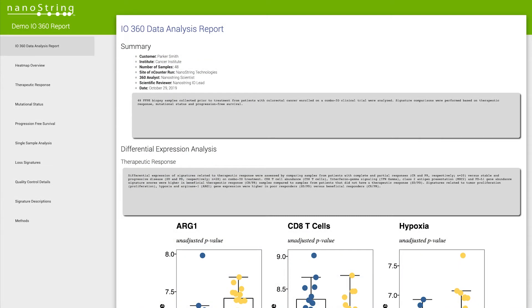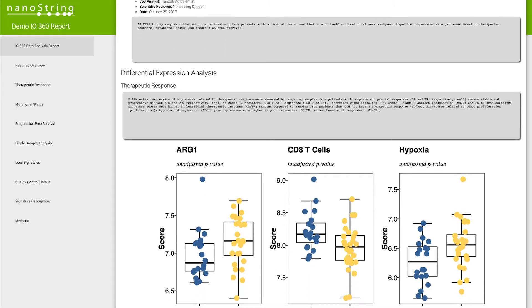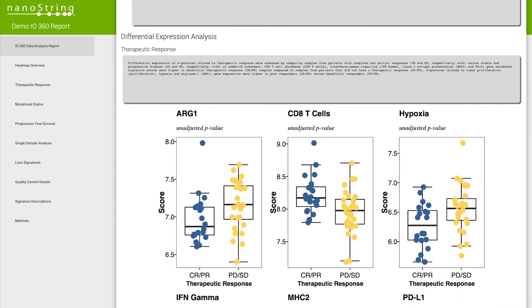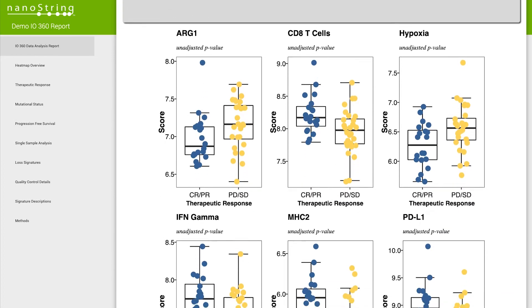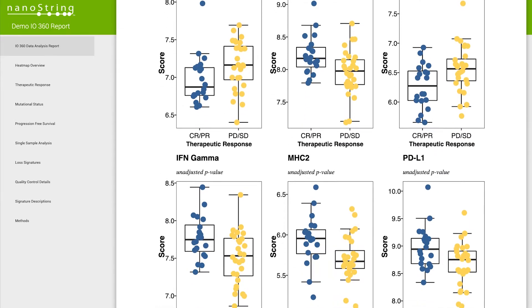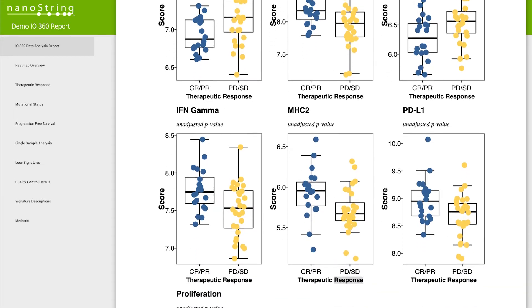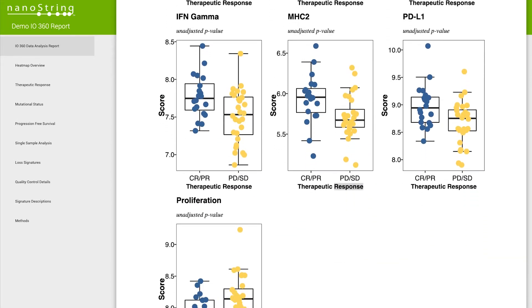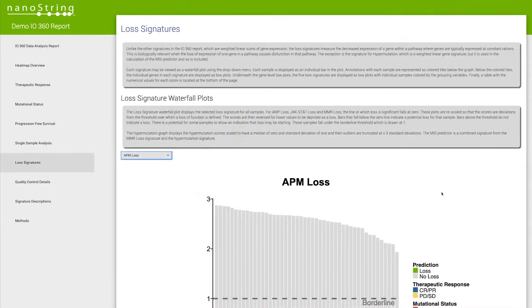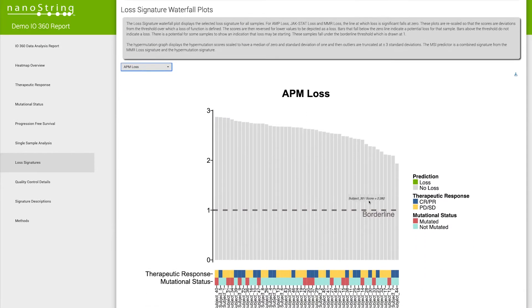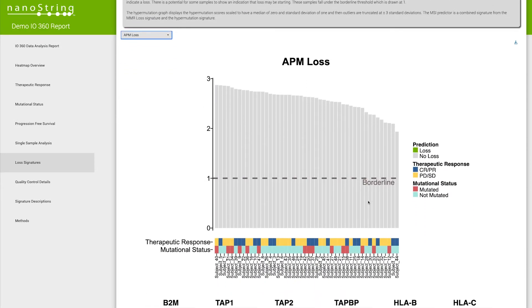The IO360 Data Analysis Report is delivered in an interactive HTML format, complete with user-friendly navigation to view the different analyses carried out in the study. From summary to specific analysis detail, the report provides you robust, ready-to-publish content at your fingertips.